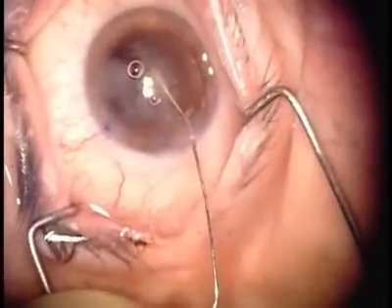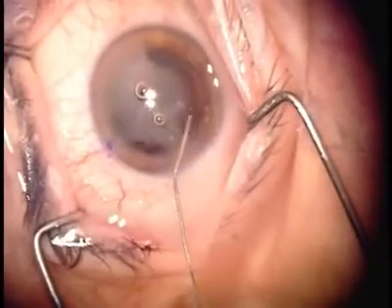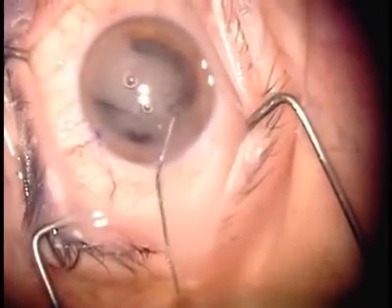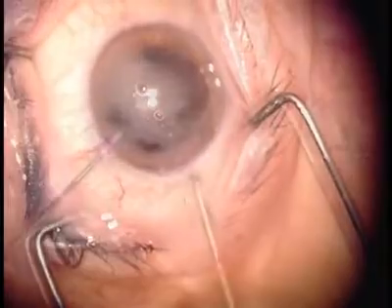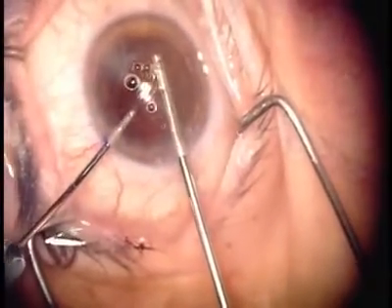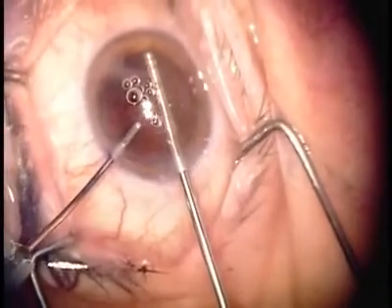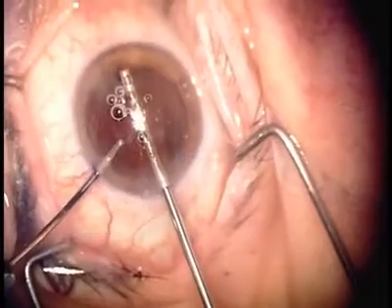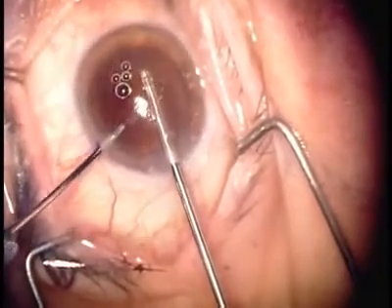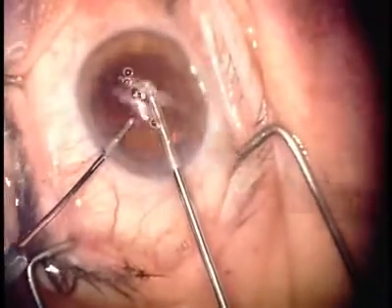Here you can see as we place this preservative-free dilute Kenalog that we don't see any stained material at this point. There's still some pockets of OVD, so we decided to go in and once again have the fluid pouring out of the wound as we remove the residual viscoelastic material. And as a result of this very poor control of the chamber, eventually the vitreous does come out around the wound. If we would have had good control, I don't think this would have occurred.